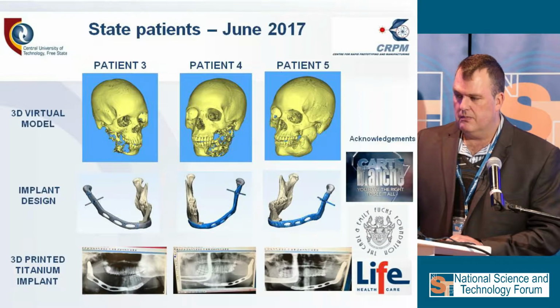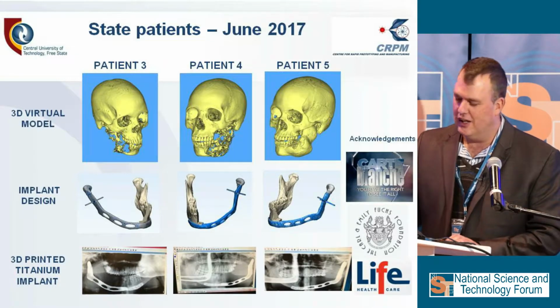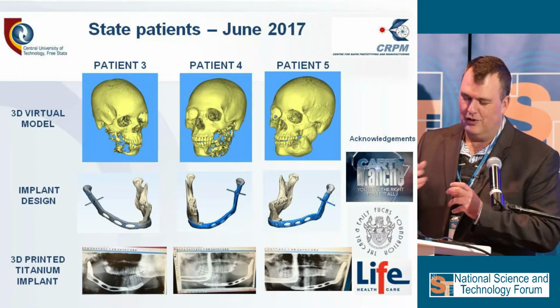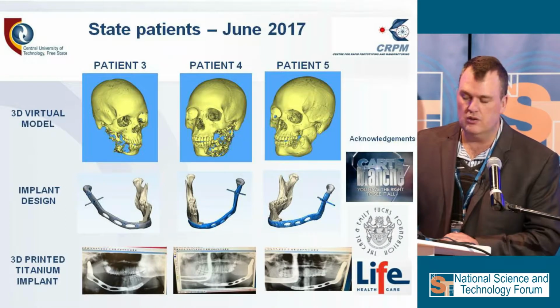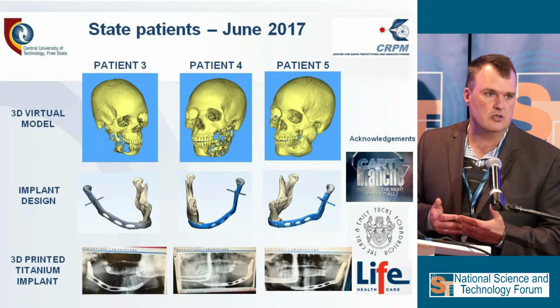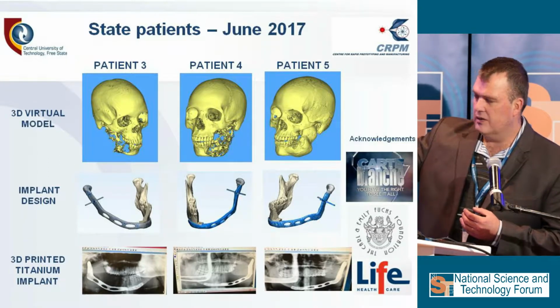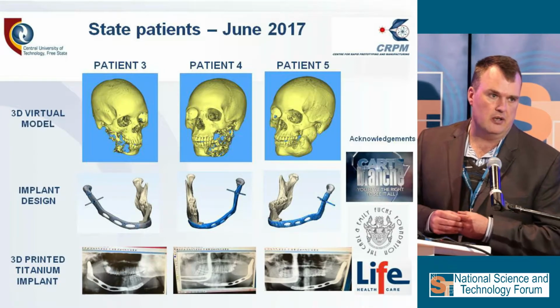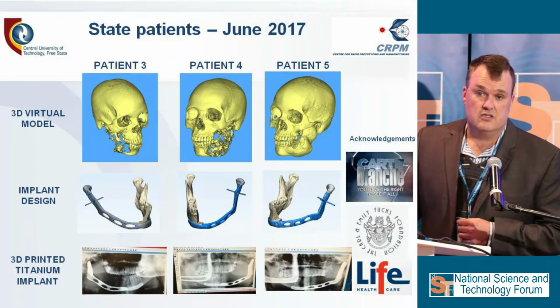Just to show you some evolution. Where we started off, it was a very solid design, and Hein was also talking about this modulus of elasticity, that if you design it very solid, you can pull a car with it. But at the end, you don't need that. You maybe can work with a very fine lattice structure, where you can have osseointegration or blood supply. In this case, the bottom left is actually bone fragments that were just ground and then put in with blood supply. And you want then a solid bone in that area. But the need is extremely high.